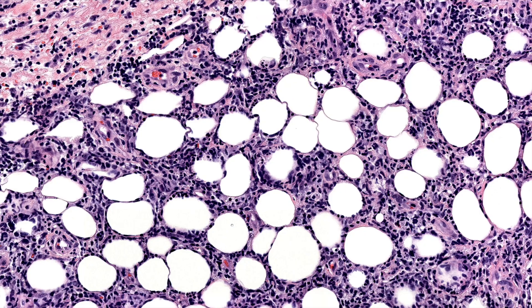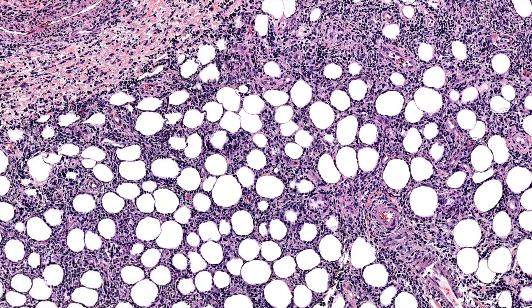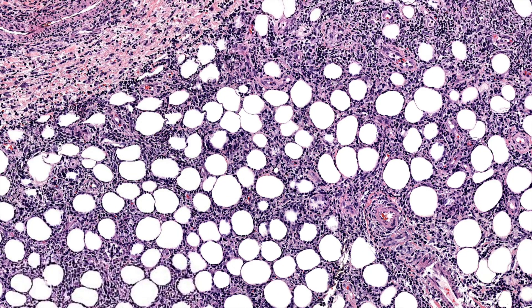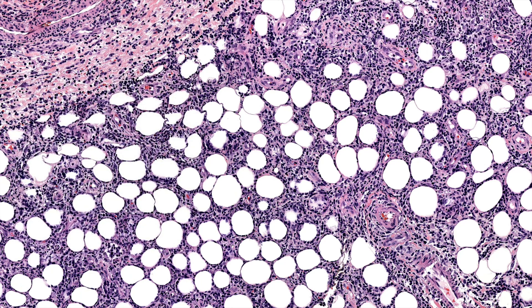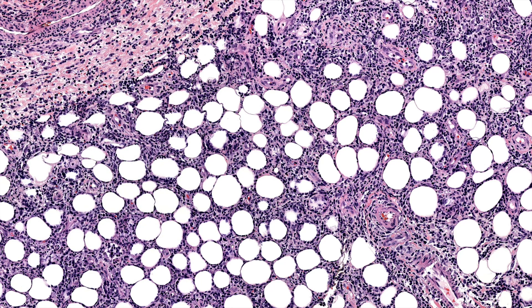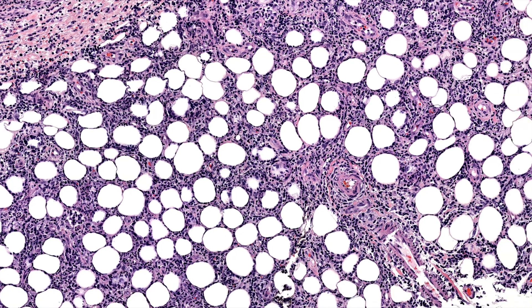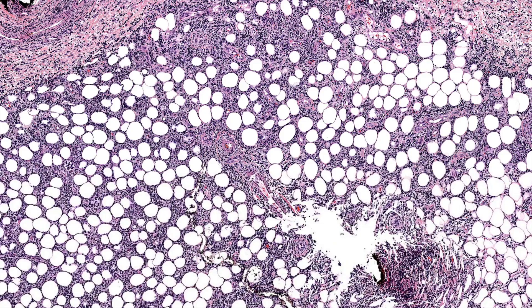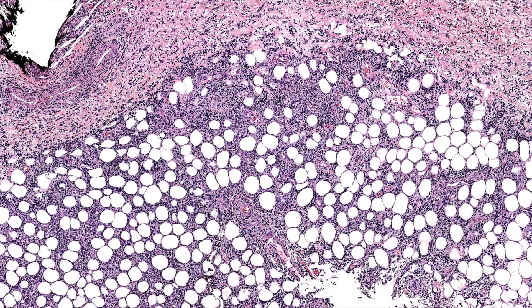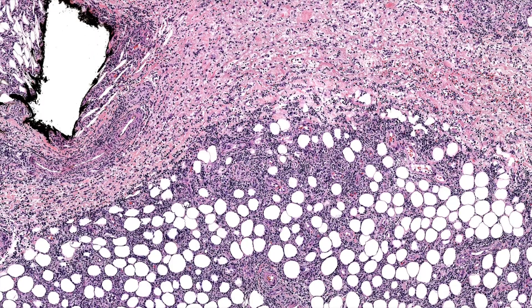So what is the diagnosis here? It's subcutaneous paniculitis-like T-cell lymphoma. That's right. So this is subcutaneous paniculitis-like T-cell lymphoma, or subcutaneous paniculitic T-cell lymphoma.